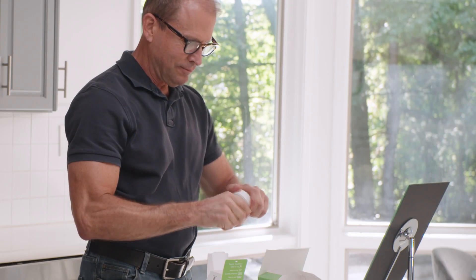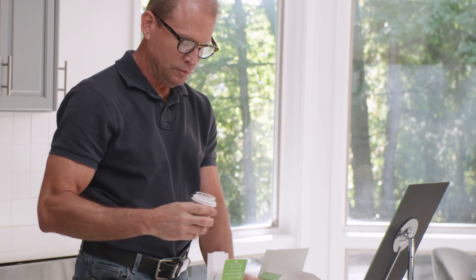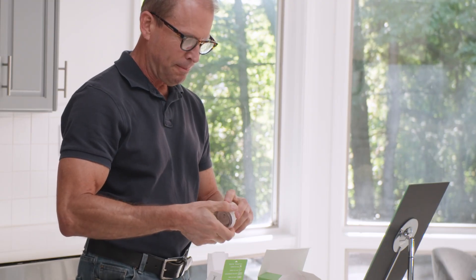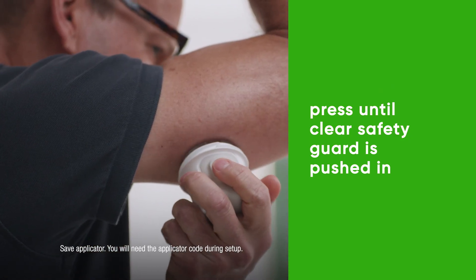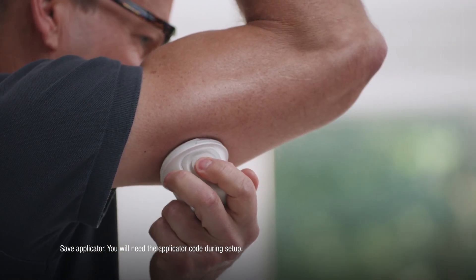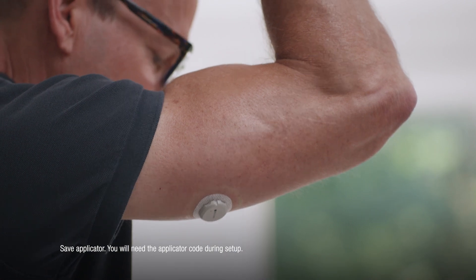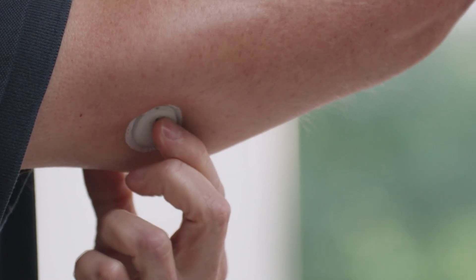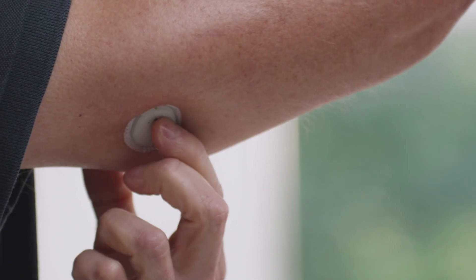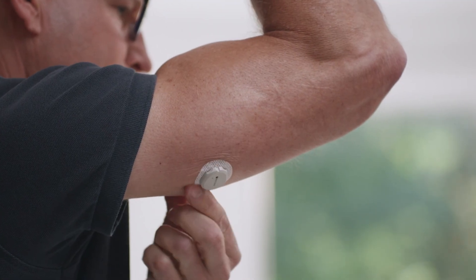Grab your applicator and unscrew the cap. Don't touch inside the applicator. Push the applicator against your skin until the clear ring disappears. Keep it pushed in and press the button. Remove the applicator. To help keep the patch on your skin, press on the sensor for 10 seconds. Then rub around the patch three times.